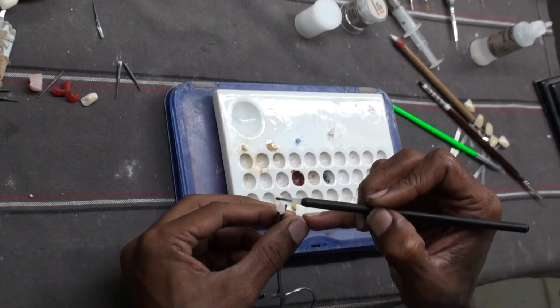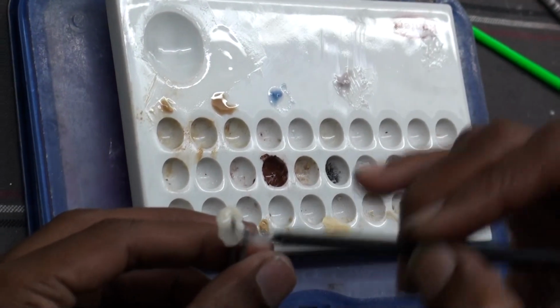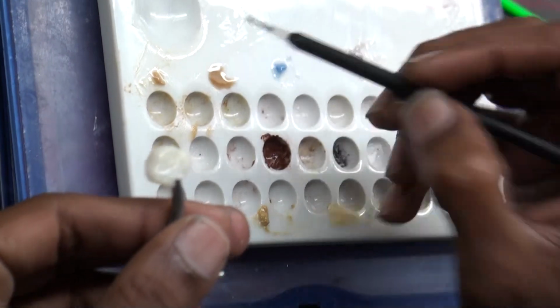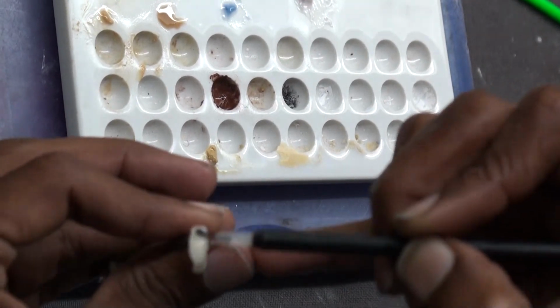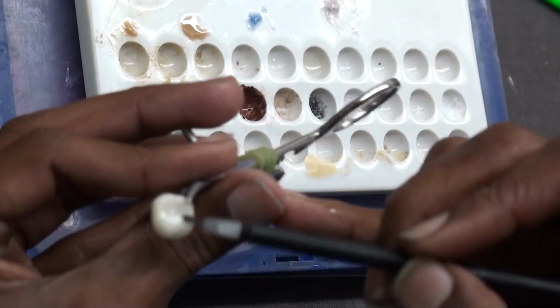Now once that's all done, what remains is the glazing and the staining. So he's taking the crown and he's applying some glaze on it. A nice even coat all around the crown. That gives it the shine.